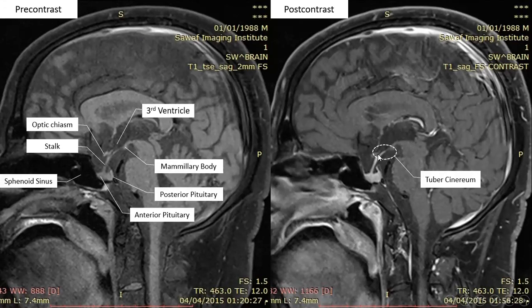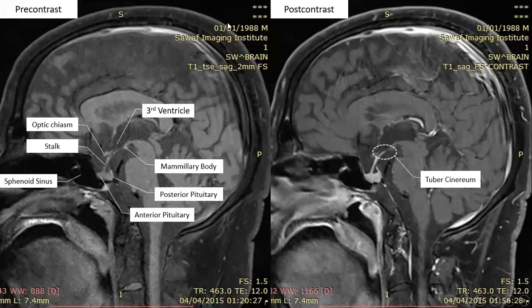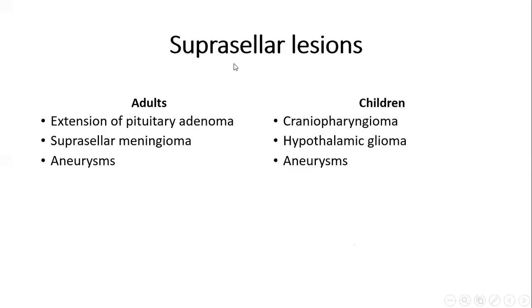This image shows how the pituitary stalk and the pituitary gland homogeneously take the contrast. Now we will talk about suprasellar lesions. The most common lesions in adults are extension from a pituitary adenoma, suprasellar meningioma, and aneurysms, while in children they are craniopharyngioma, hypothalamic glioma, and aneurysms.